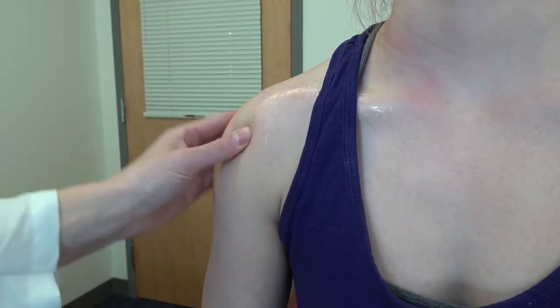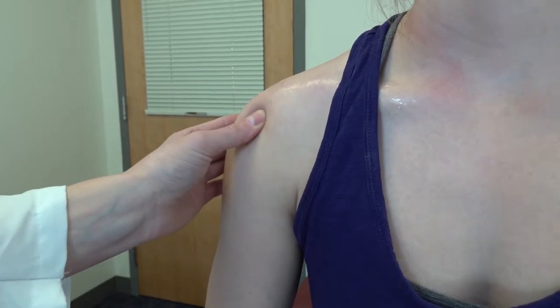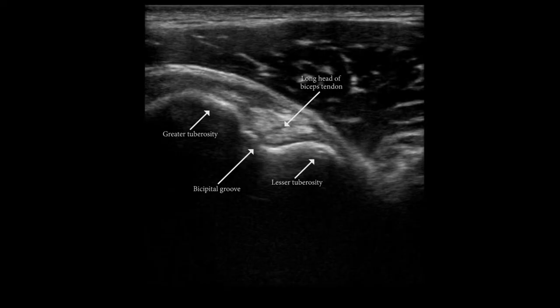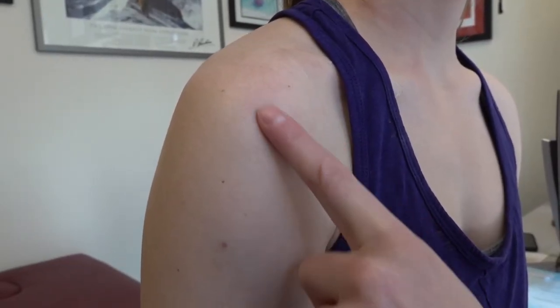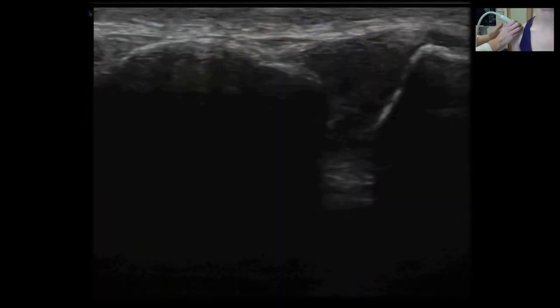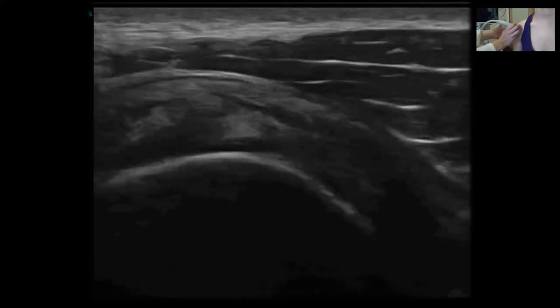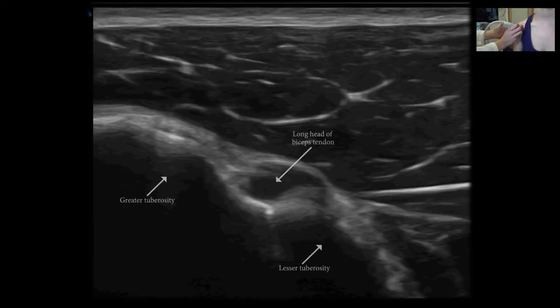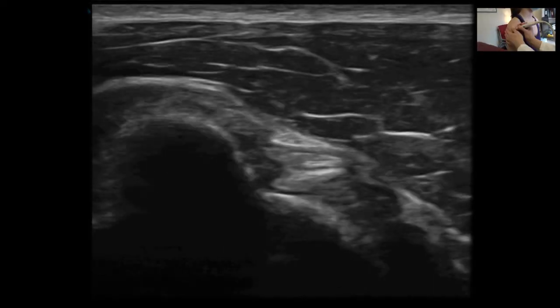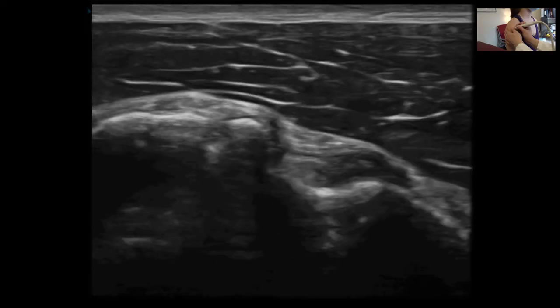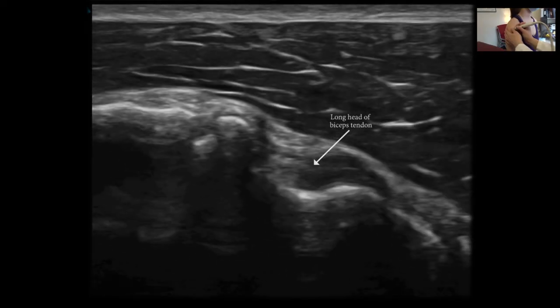From the AC joint, palpate inferiorly until you locate the bicipital groove, which is situated between the greater and lesser tuberosities of the humeral head. The long head of the biceps tendon travels within this groove. Alternatively, move the probe inferiorly from the AC joint until the greater and lesser tuberosities of the humeral head are visible. With the probe oriented transversely at the bicipital groove and the marker facing the patient's right, examine the tendon.